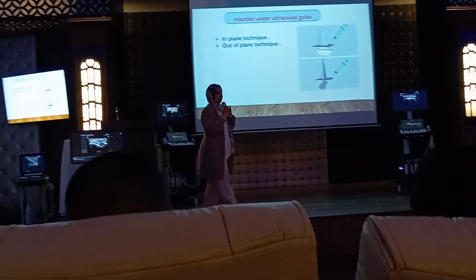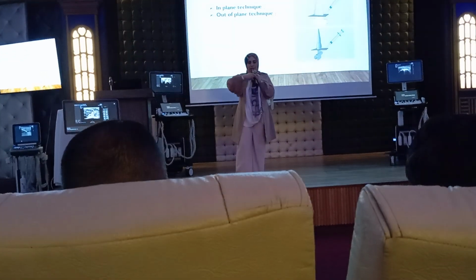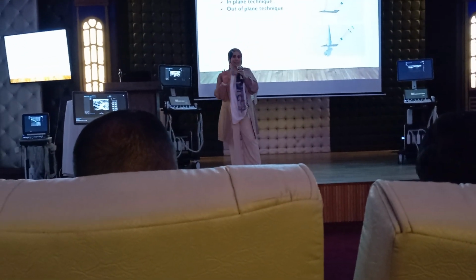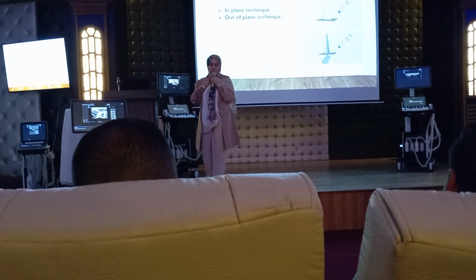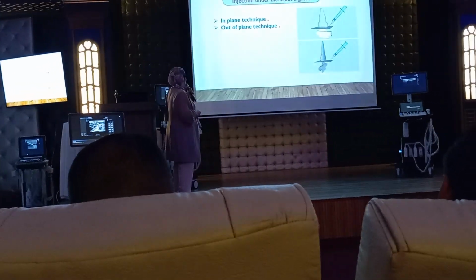Another technique is the out-of-plane technique, by putting the needle perpendicular to the ultrasound probe. But this is not preferred. You can do this for FNA of the thyroid if it is a superficial nodule. But in pain management, we can't do this.